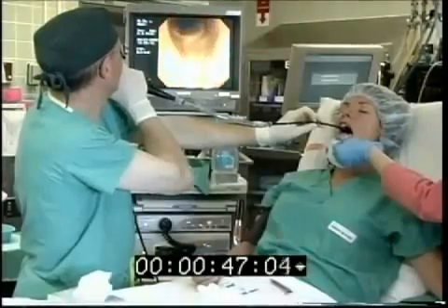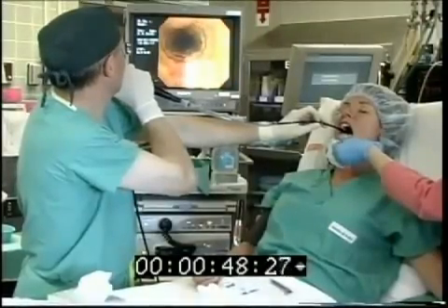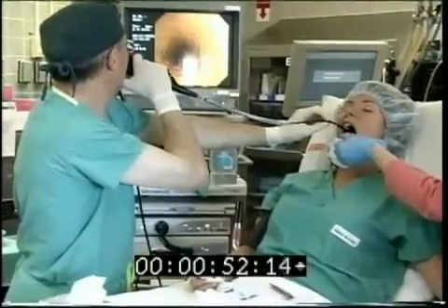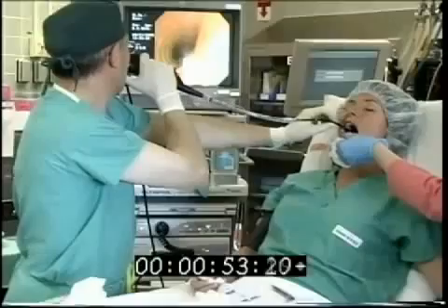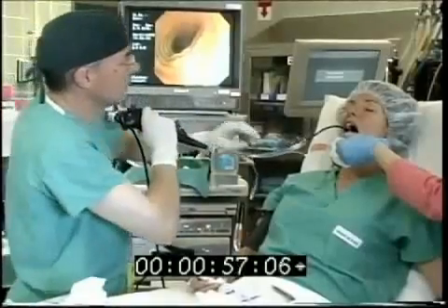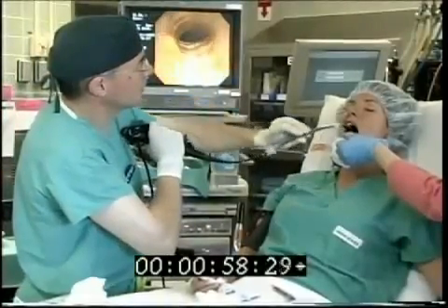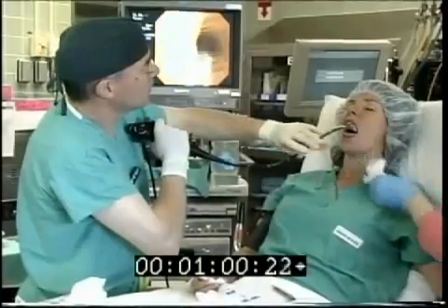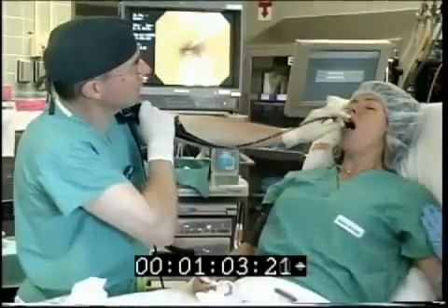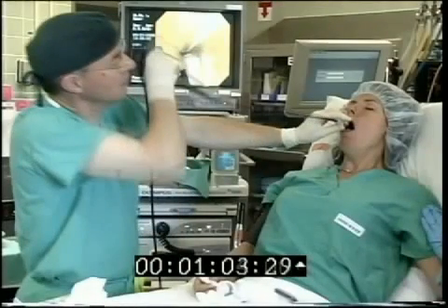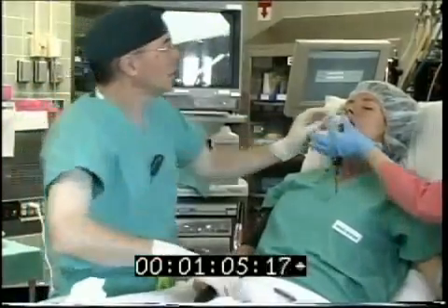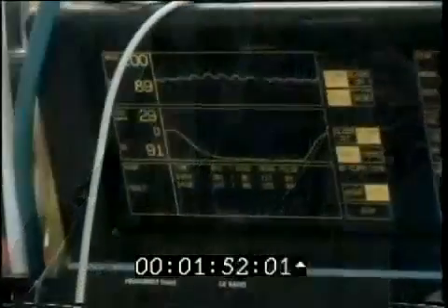The scope is then advanced in the midline through the glottis and positioned proximal to the carina. As the scope is advanced through the larynx, the patient is again instructed to take a deep breath to maximally abduct the vocal cords and thereby facilitate passage of the scope. Having positioned the tip of the bronchoscope in the trachea, the practitioner should advance the endotracheal tube over the scope to follow the natural curve of the airway. As the tube is advanced, the patient should be instructed to take a deep breath to maximally abduct the vocal cords. The correct position of the endotracheal tube is confirmed endoscopically before the scope is removed, and can be further confirmed by movement of gas through the circuit and capnography.